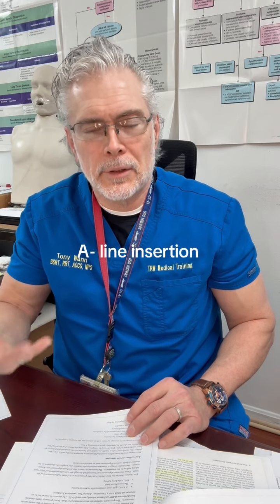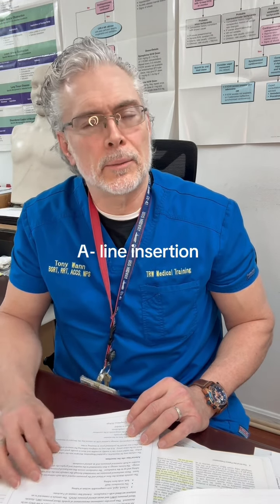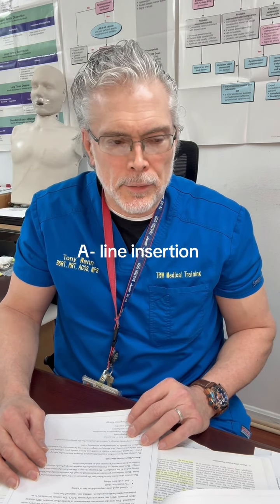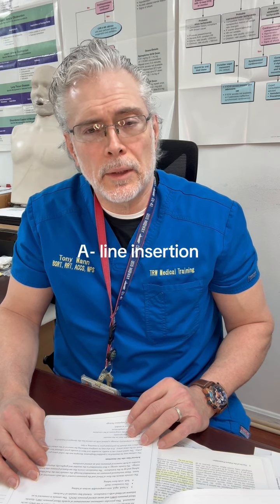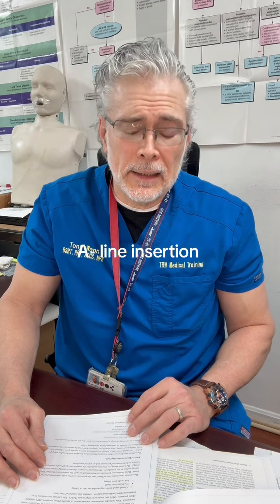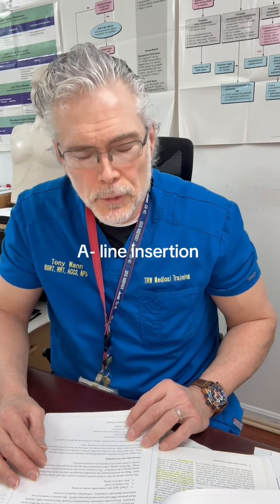We'll talk about the different type of lines, the hard, rigid, non-compressible type of pressure tubing that you have to use for A-lines. Show you the sterile technique in prepping, and how to position the radial A-line or the brachial. And yes, I do femorals too, but it depends where you work.